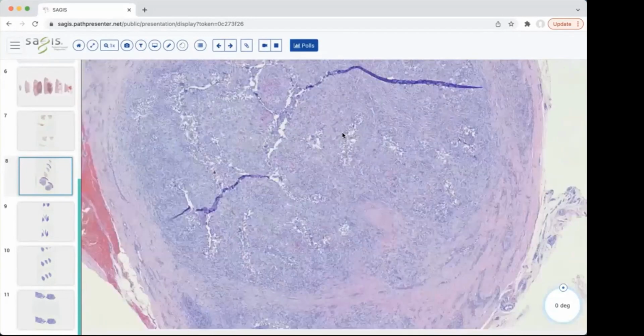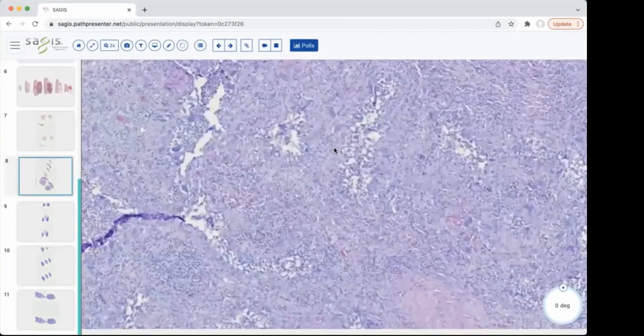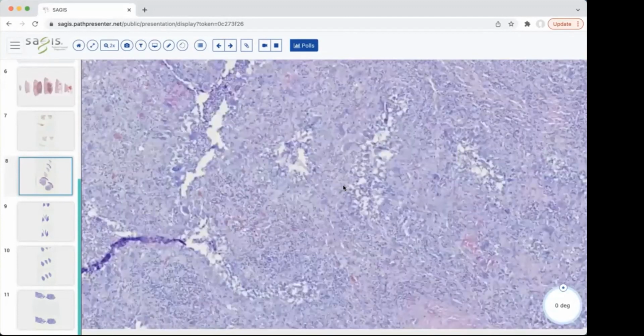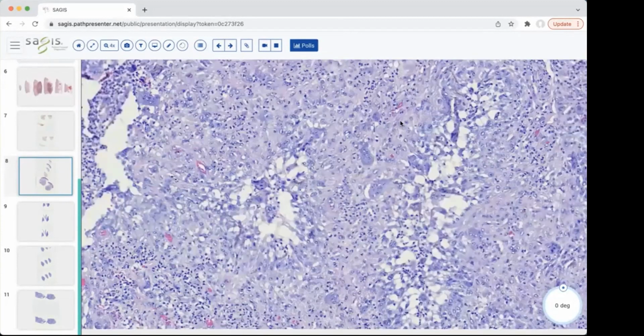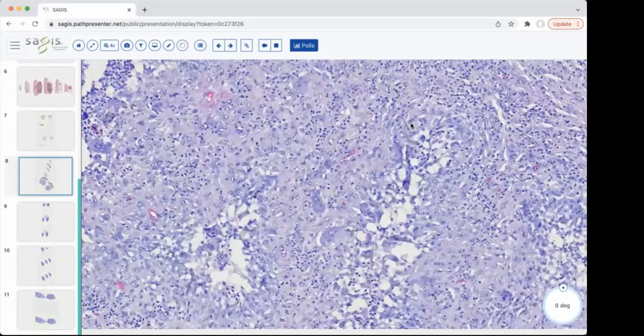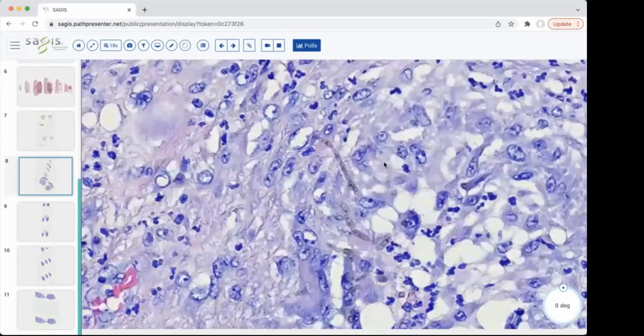So I think the big thing is noting that you're dealing with a suppurative granulomatous inflammatory infiltrate, and then you're going on a bug hunt after that. So there are fungal stains that you can do, but for these with the pigmented hyphae, you really don't need a fungal stain. You might do that just to better highlight them, but you can see them definitely just here on the H&E, even with a poor video quality. Good.